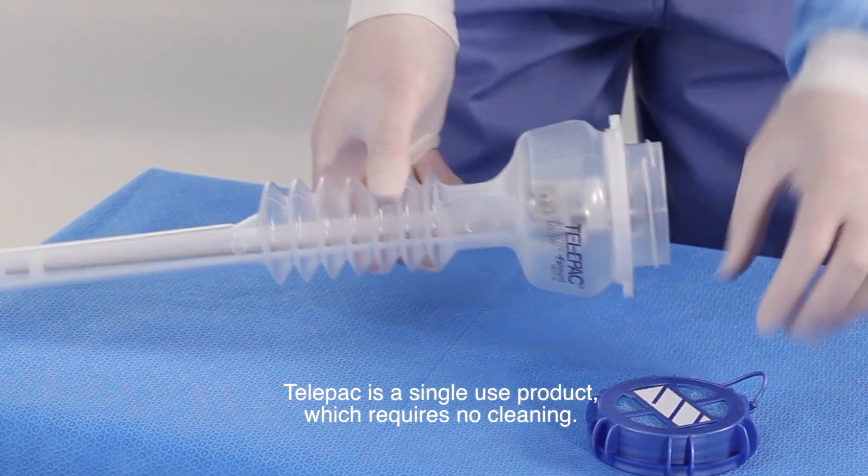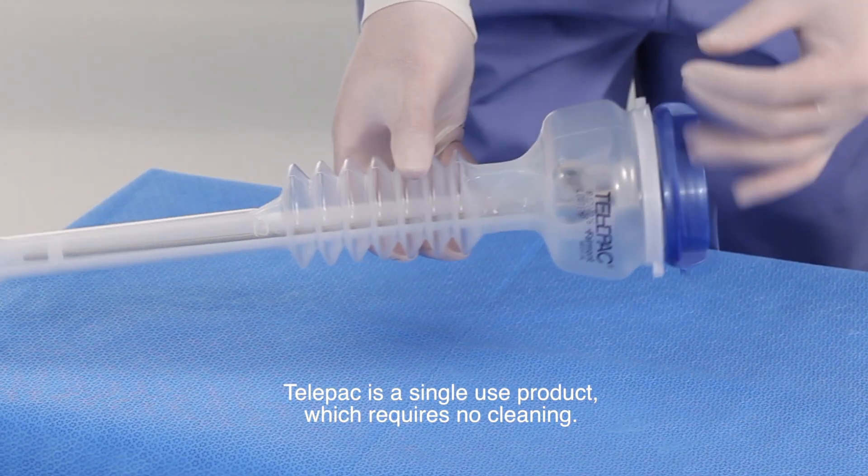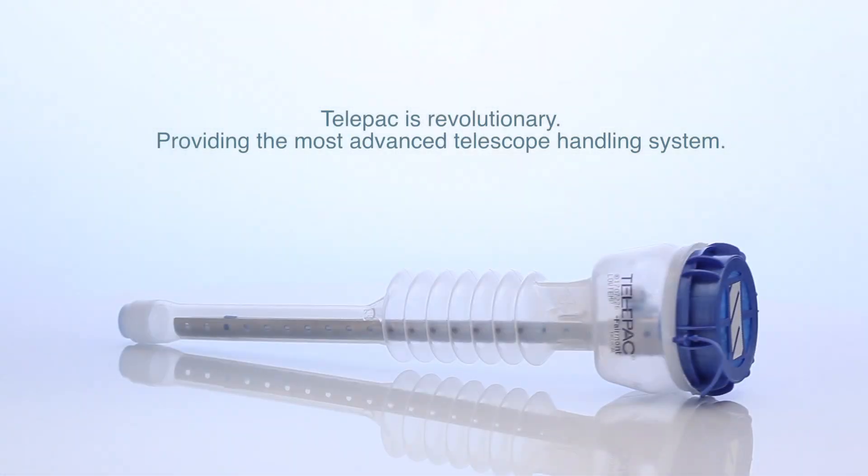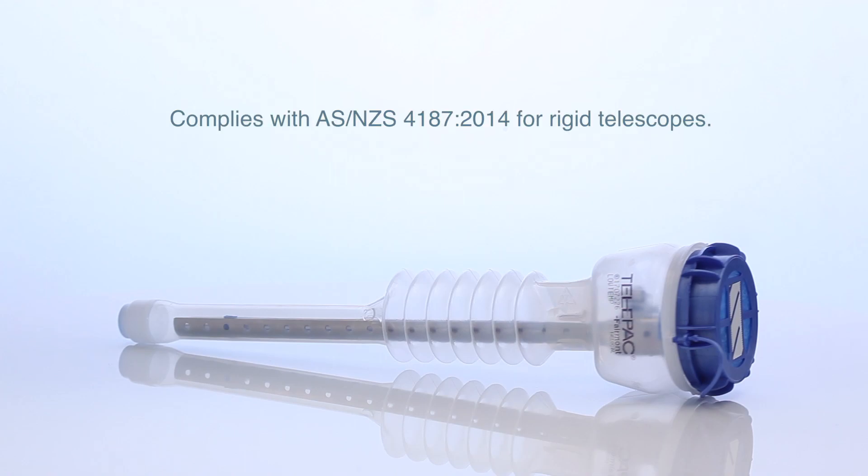Telepack is a single-use product which requires no cleaning. Telepack provides safe transportation. Telepack is revolutionary, providing the most advanced telescope handling system. Complies with AS NZS 4187 2014 for rigid telescopes.